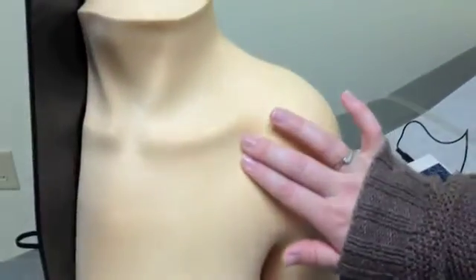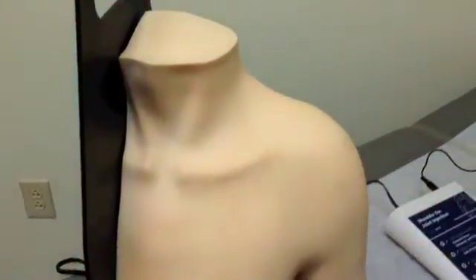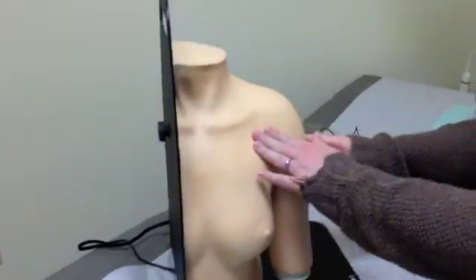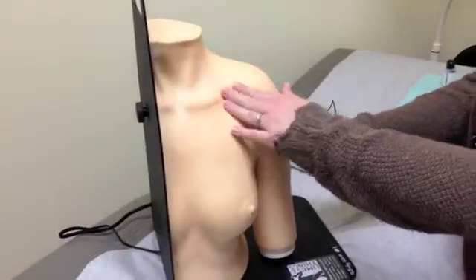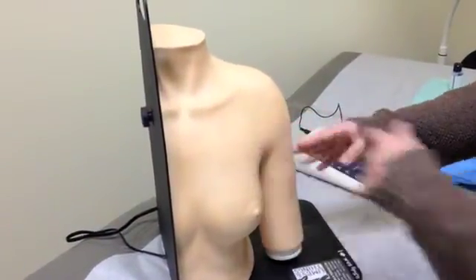So did you experience pain with any of those? Yeah, it was like just to this region here. Yeah, right there with all of them. Okay. So but just on my left side. Just on the left side. Yeah. So we'll go ahead and do an injection to the site to hopefully help with joint function and to decrease your pain. Okay. So like I said, we're going to do the anterior approach.